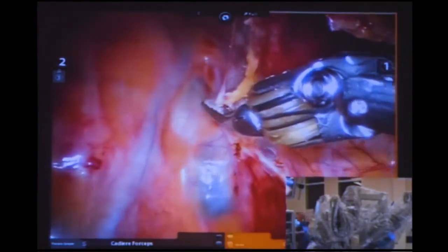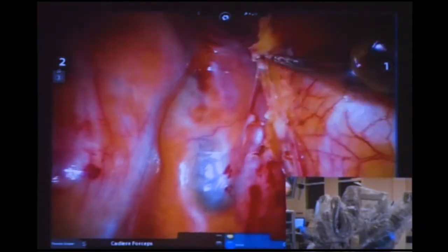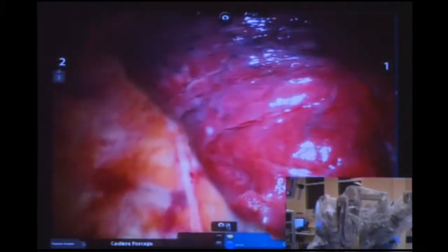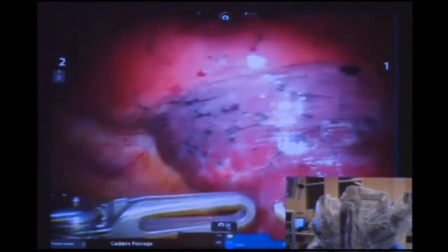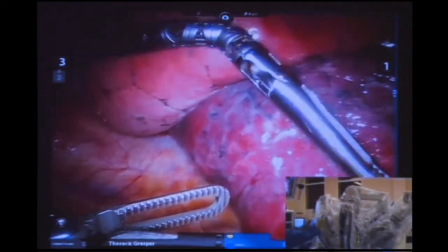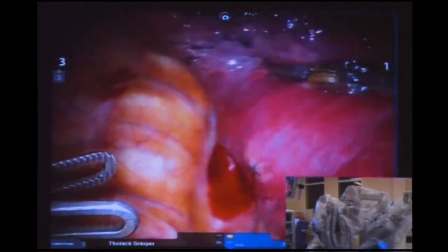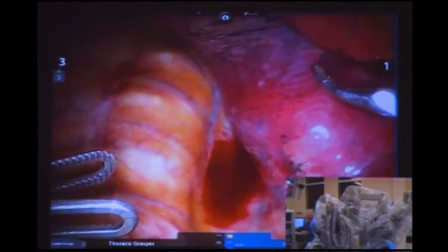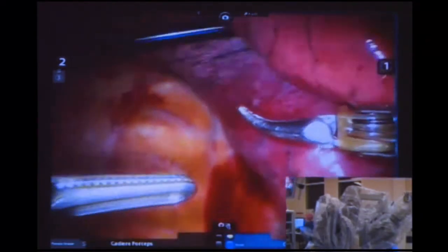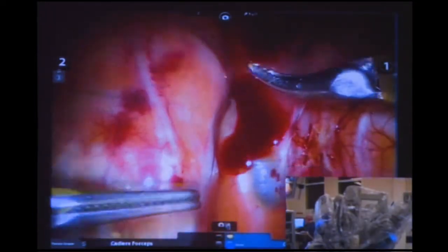There's the inferior vein coming up there quite nicely — we'll be opening that in just a second. The nice thing about robotics is you've got three arms, so you're your own assistant. You're also in full control of the camera — it's a good quality camera. The lung is a little bit inflated but the CO2 is getting it down, even if lung isolation isn't perfect.